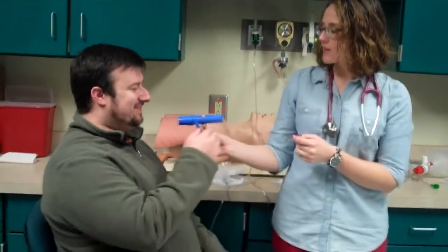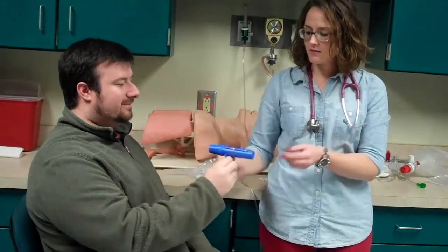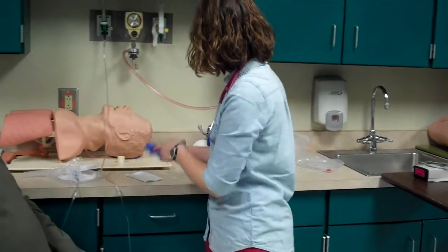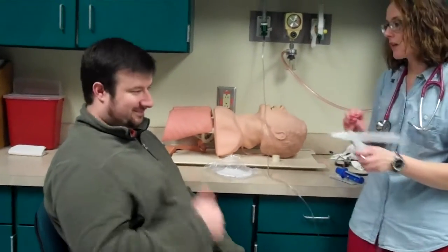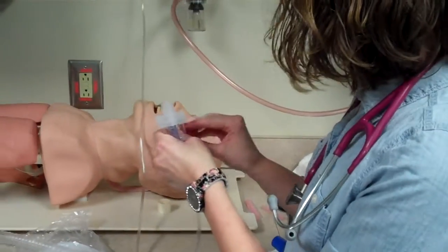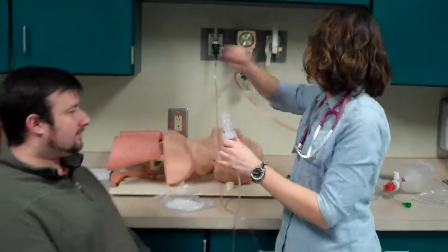That's my son. Let's try it again. Take a deep breath in and blow out. Got 550 that time. Good. All right. So we're going to say 550 is your best. Man, I'm gonna proud of you. We're going to hopefully get this treatment in, and it's going to make it better, okay? All right. And this is just your medicine that I'm putting in here. We're gonna put this on, and I'm gonna turn this on, and you're gonna see the mist come out.